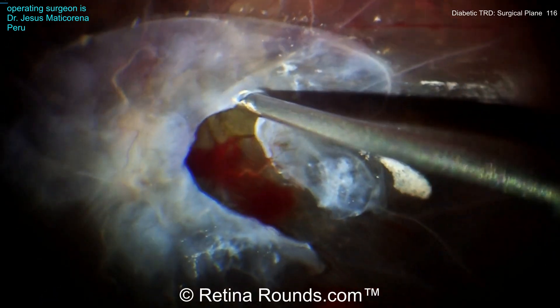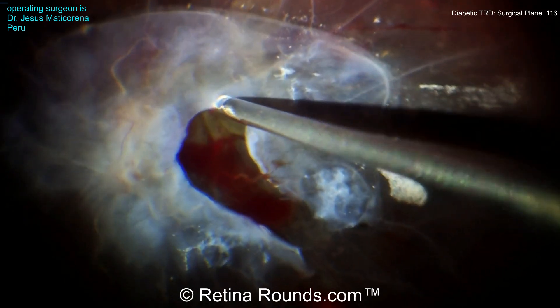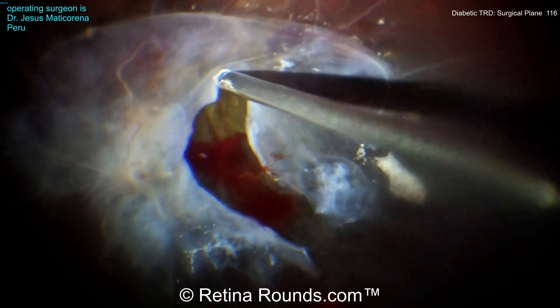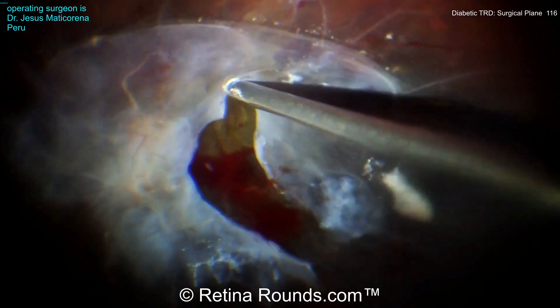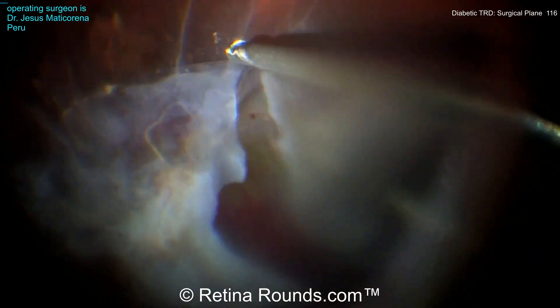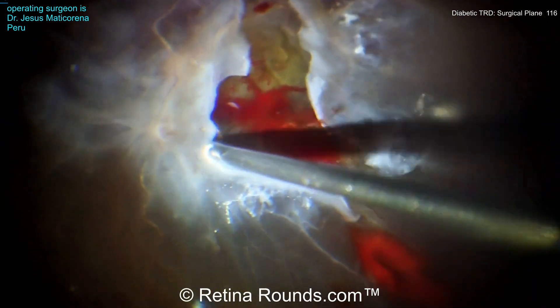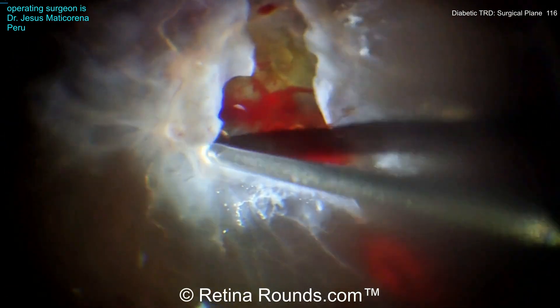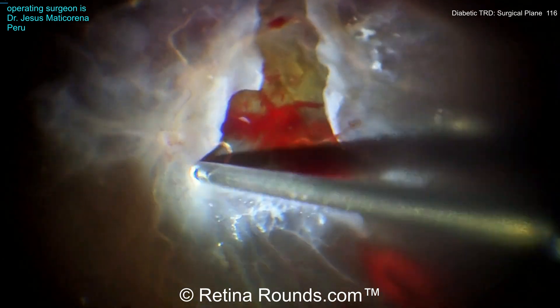You'll remember from prior episodes that you can generally be confident in cutting through these membranes if you can see that translucent or thin fibrotic tissue through the mouth of the cutter. It can be a little bit dangerous using the cutter through very tightly adherent areas over the macula, but using the cutter, it can be gently elevated, using the cutter almost like a hook.